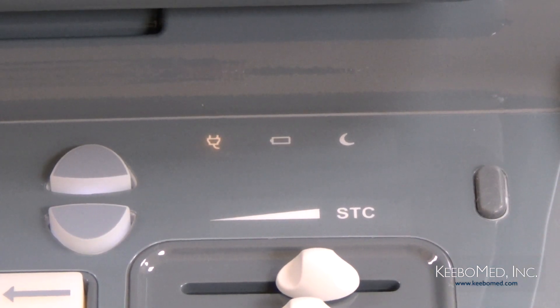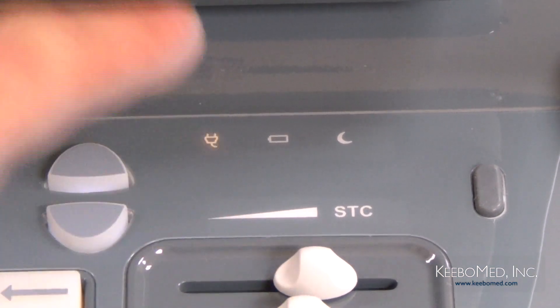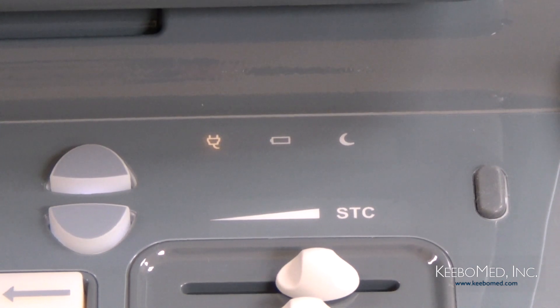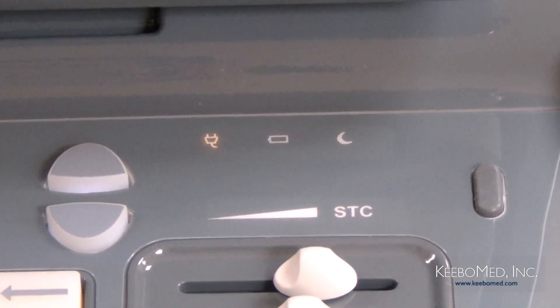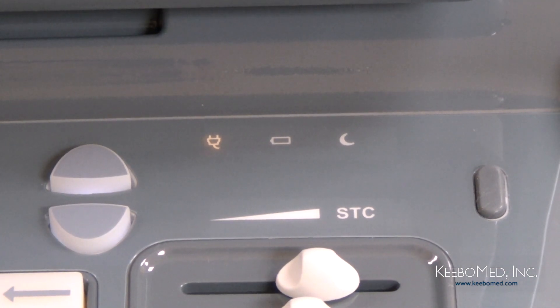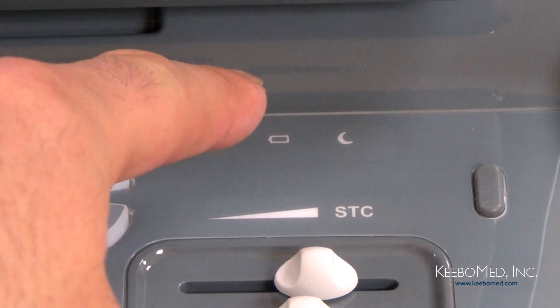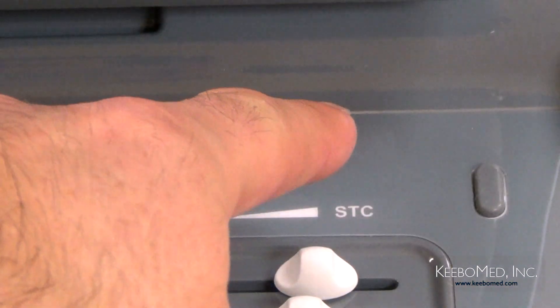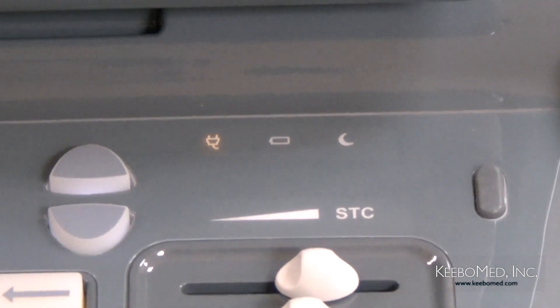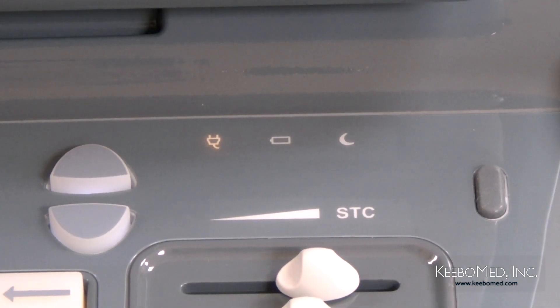The final feature to highlight is the indicator lights above the STC control. From left to right: the Adapter indicator lights up when the unit is connected to power. Next is the Charge indicator, which lights up when the battery is charging and goes out when charging is finished. The last indicator is the Sleep indicator, which is lit up when the unit is in sleep mode.